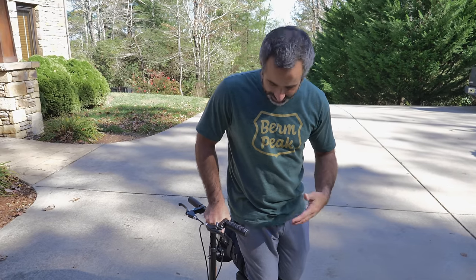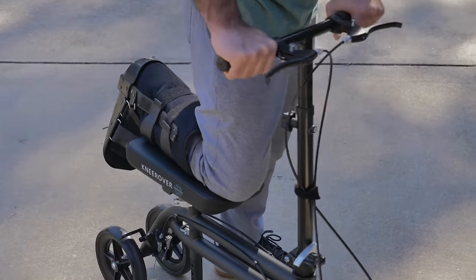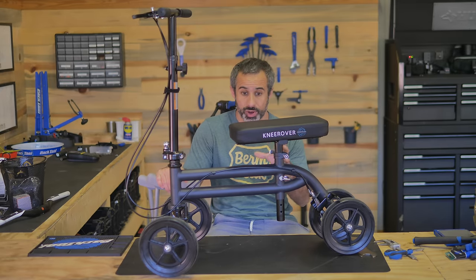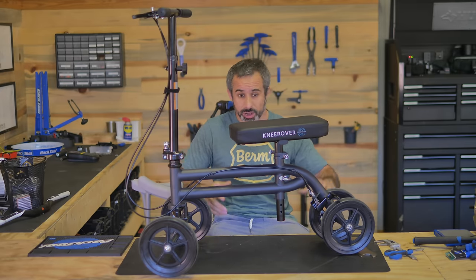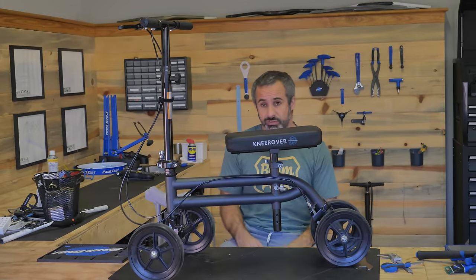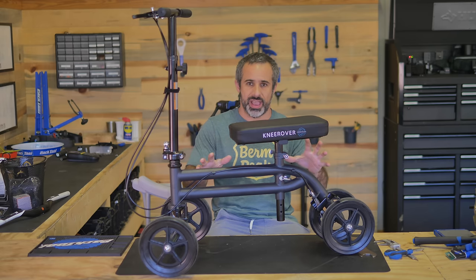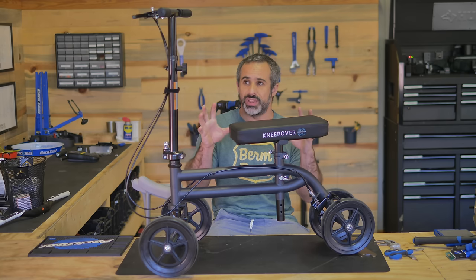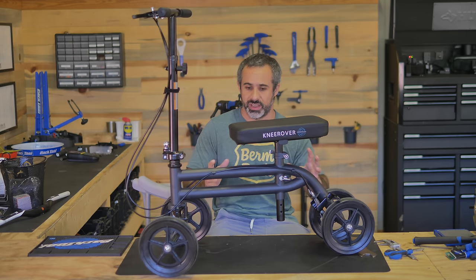Coming from bicycling and seeing that a lot of this is bike parts — it's got a head tube, it's got wheels and all that — I know it could be better. When I mentioned I'd be doing a knee rover upgrades video, people were like 'you're going to put a dual crown fork on it, big wheels, brush guard, recovery hooks.' Look, I need to use this to get around. This is my reality. So I'm going to be dead serious about this — we're only doing things that are practical and actually going to make it better.